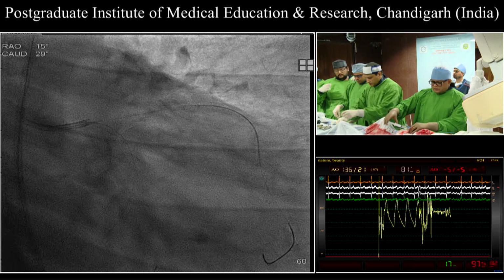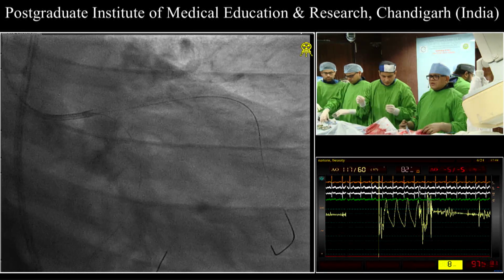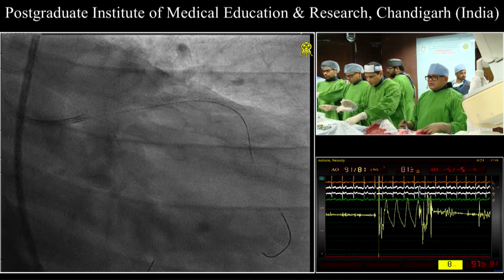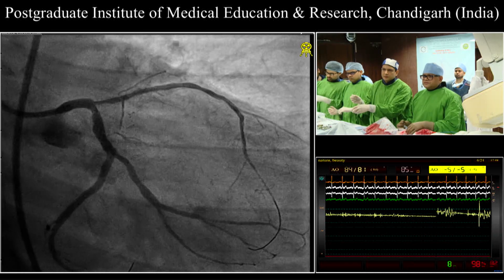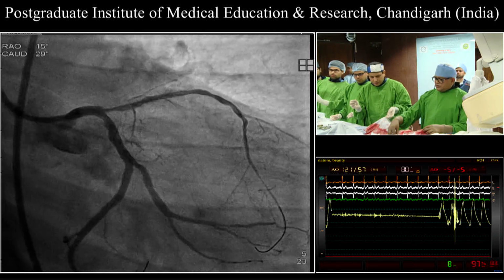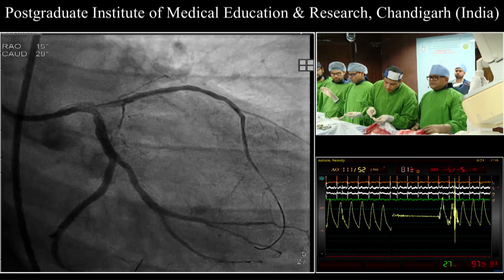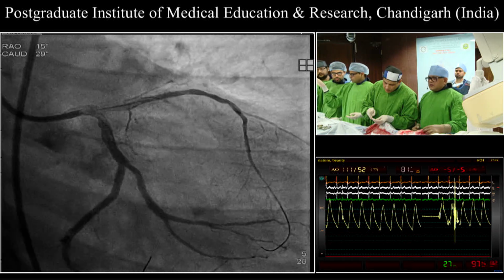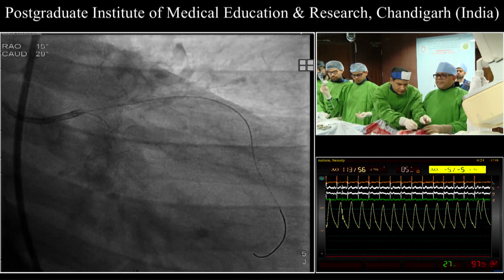Well, when under-expansion is there, we are now considering the valuable shock wave. This is outside the recommendation, but we really see the efficiency of this technique, even in stents that have been implanted a long time ago. So we have been able to expand a stent.